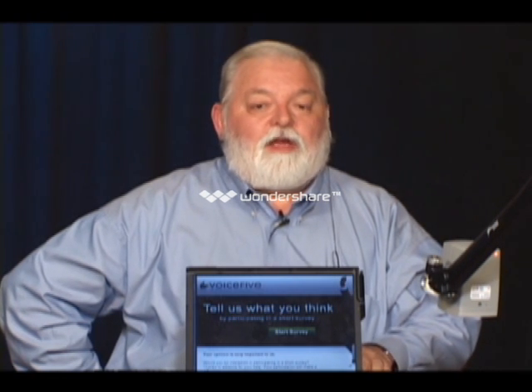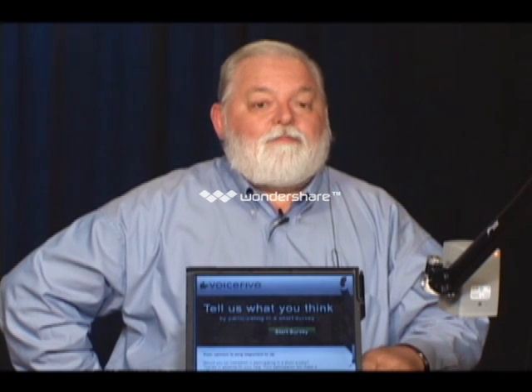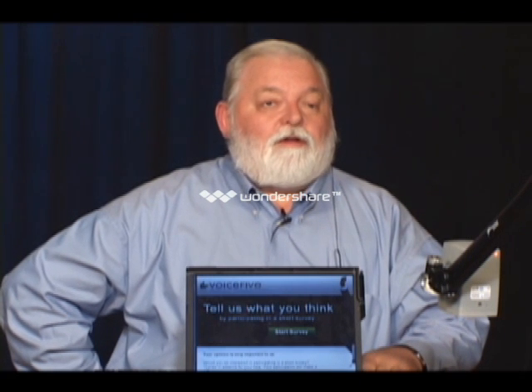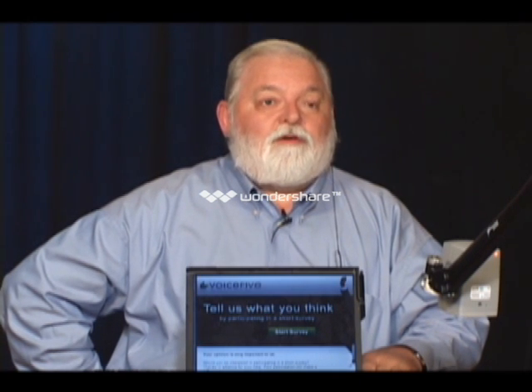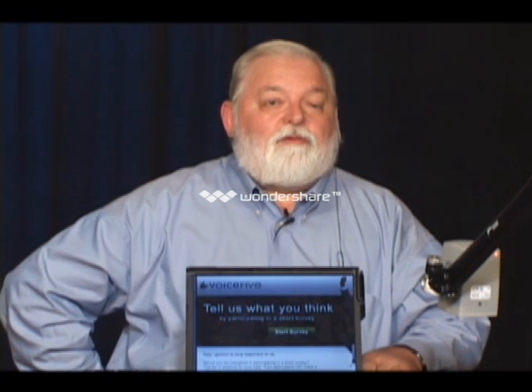If you run Magic with that, then you get the same features. You get the spoken word with JAWS, but Magic then takes that place where the virtual cursor is and puts up a little green highlight or a green box around wherever it is to show you, right here is where I am. So if you can see the screen and I can't, you say, well, right now you are right below the button we're trying to get to.